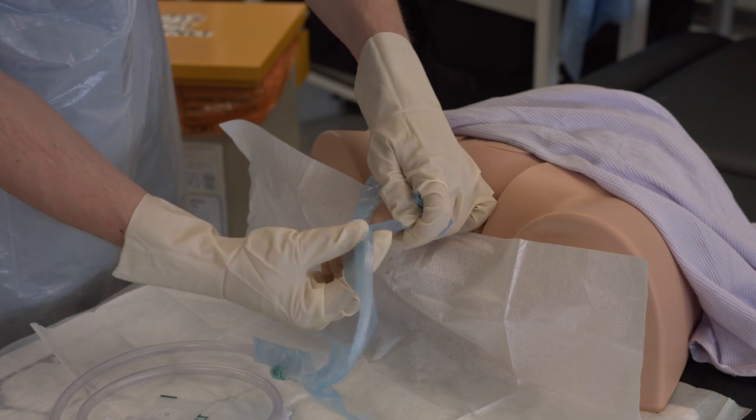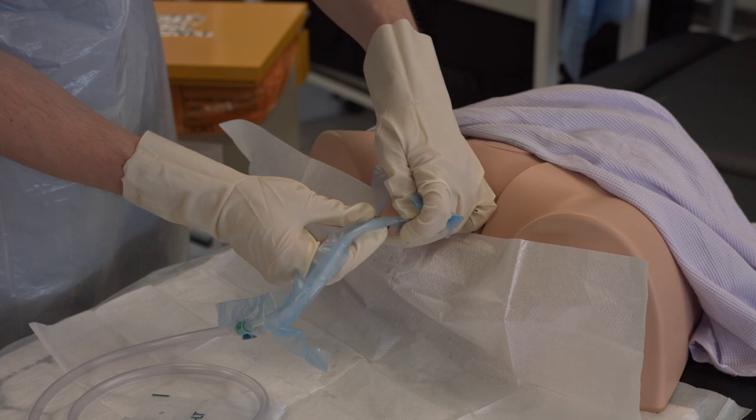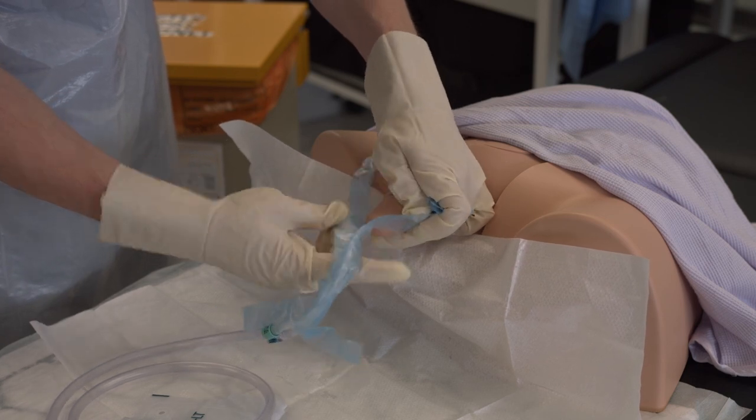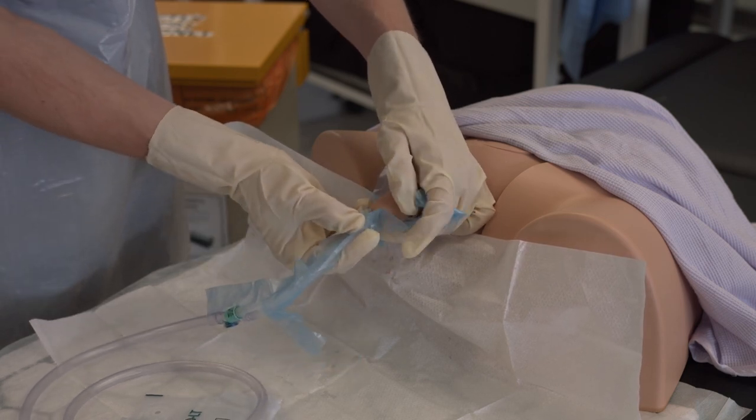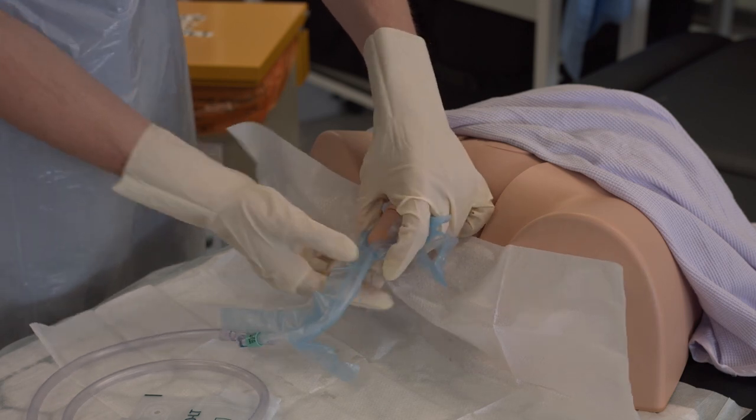At some point in a real patient you would see urine flowing down the catheter. In an exam you may be told you have reached urine. When that happens, you would insert a further 8 to 10 centimeters and then inflate the balloon.